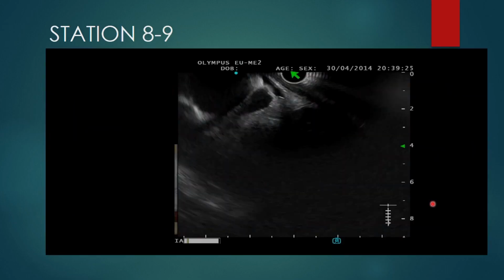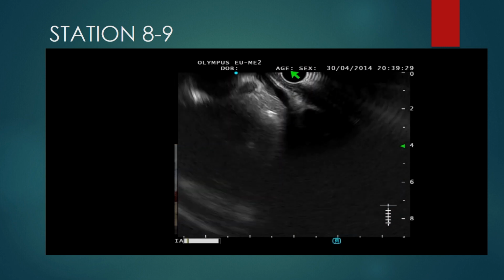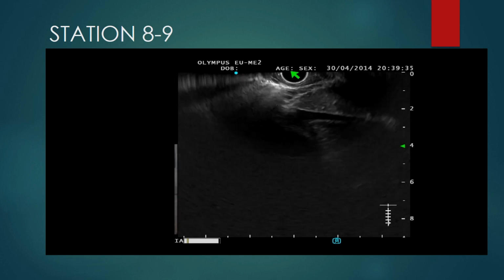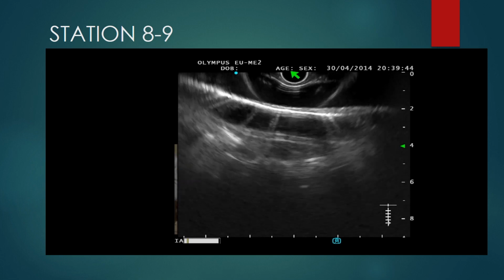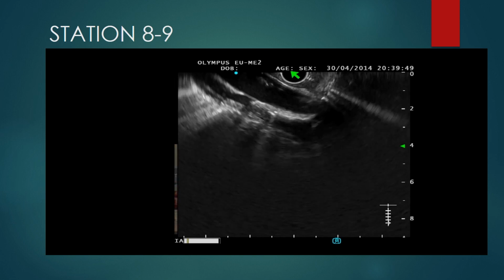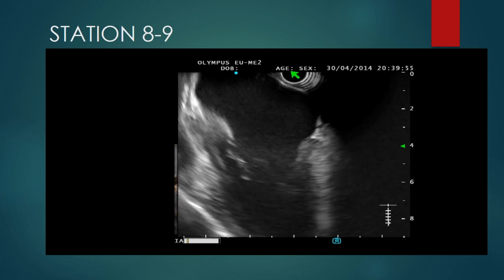So can we play this one, please? Just click on. So here we are starting. Yesterday we demonstrated this, Dr. Pawan nicely demonstrated even with the EBUS scope. We are starting from the GE junction, and after examination of the left lobe of the liver, we move forward, backwards into the esophagus, and we focus on the aorta in a completely anti-clockwise direction, and then rotate the scope in the clockwise direction until you get the aorta. So you will be covering the 360 degrees, and we have to do that every 2 centimeters until we reach 25 centimeters. That's how we pick up all the things.